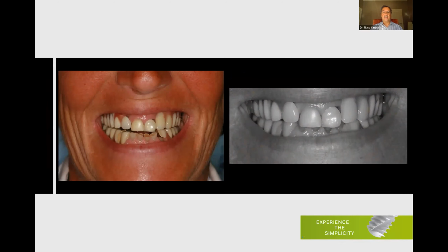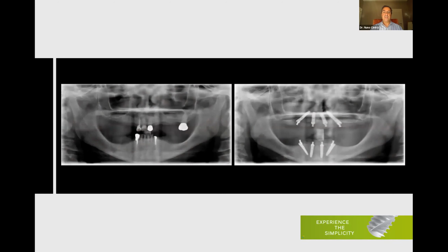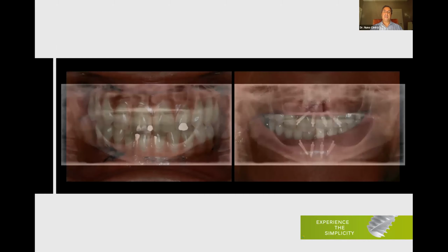For instance, in a case like this one, of course we have to reduce bone, on the upper and lower. Otherwise, we will not be able to uncover the transition zone of these patients. As you can see here, look at the amount of bone that I had to cut. On the X-ray on the right side, you can see that I cut the bone almost through to the floor of the sinus on both sides. I couldn't cut anymore, okay?